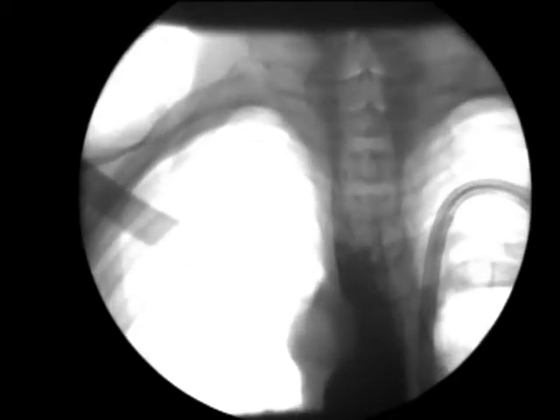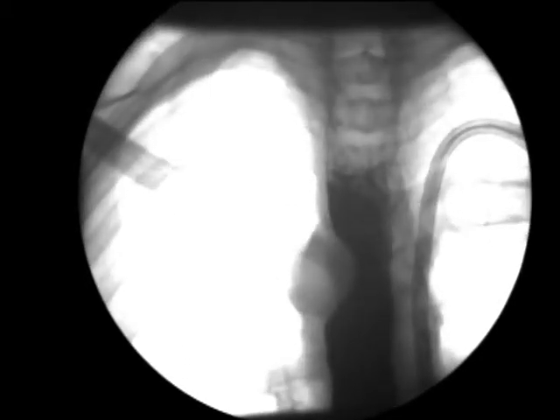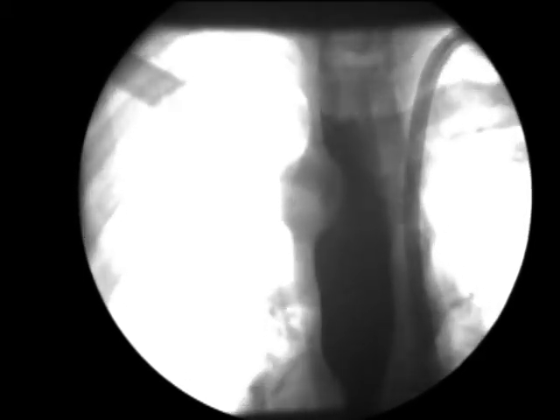And what I want to do is get down low enough to see, is this a narrowing, what's going on here. And as we get to this level, you'll see that there is an absolute blockage. There's nothing in the stomach. It's absolutely empty. This is a patient where you suspect cancer. Can you swallow it in, and this has gone on for a while without any diagnosis.